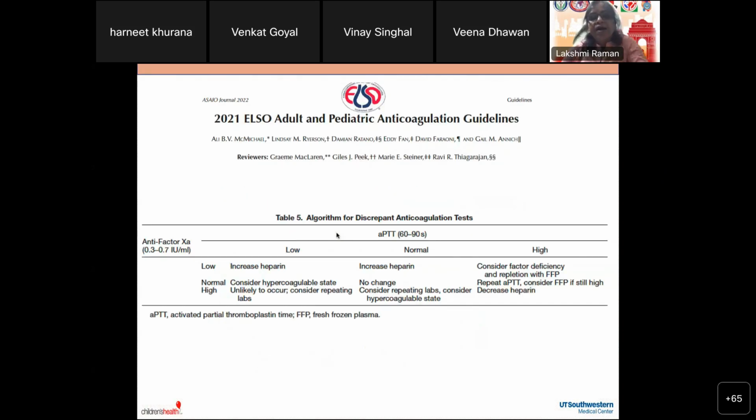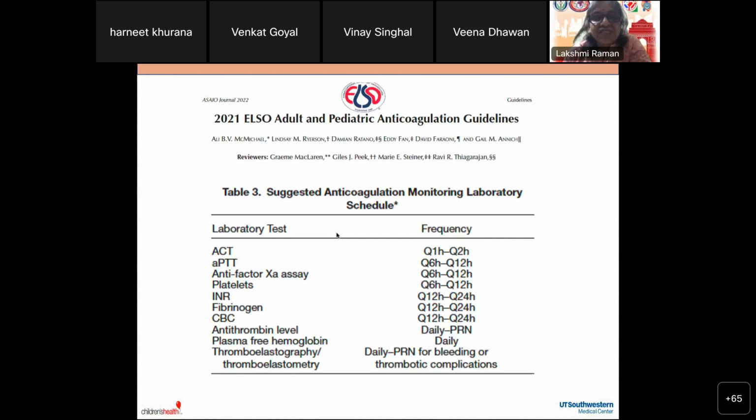So I want all of you to, sorry, can you just go back to the previous slide, please? In 2021, ELSO also published an adult and pediatric anticoagulation guideline, and I think it's a very good baseline to start, especially if you're a new program. So what does ELSO say in terms of the anticoagulation monitoring that we need to do and the frequency?